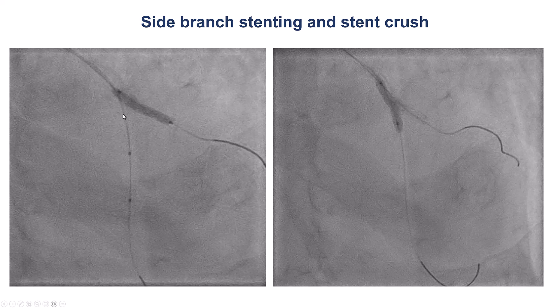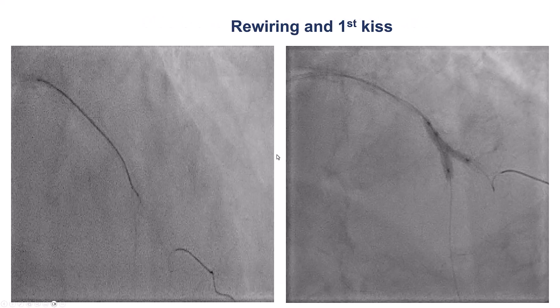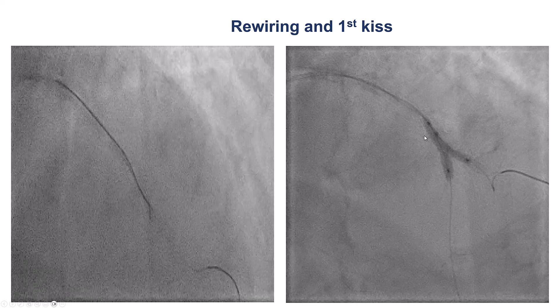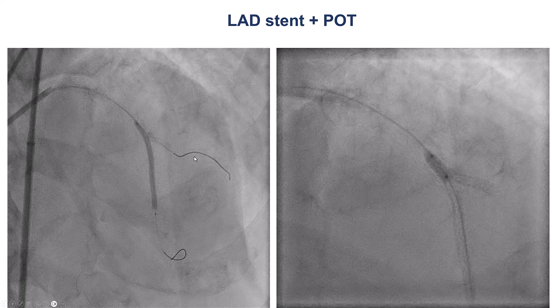We decided to stent the LAD using a two-stent technique because of the areas of dissection. The best approach was to use the DK crush technique because we maintain wire position into the main vessel throughout the procedure. We stented the diagonal, then crushed the part of the diagonal stent protruding into the LAD. We rewired the diagonal branch and did the first kissing balloon inflation. Then we placed the stent into the LAD, jailing the diagonal branch.